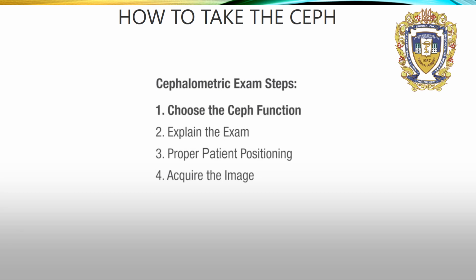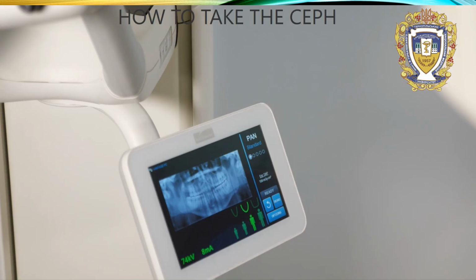First, choose the appropriate Ceph functions. Second, explain the exam to the patient. Third, properly position the patient. Last, acquire the image.